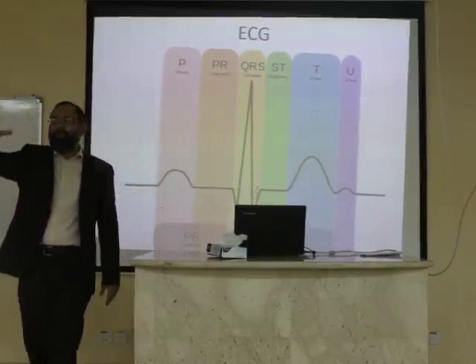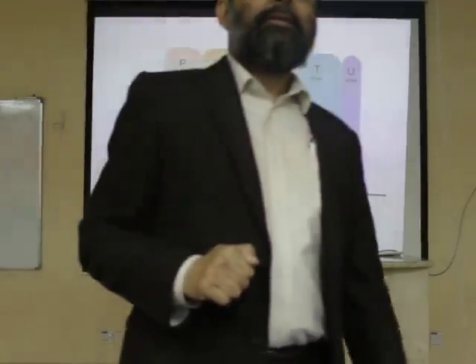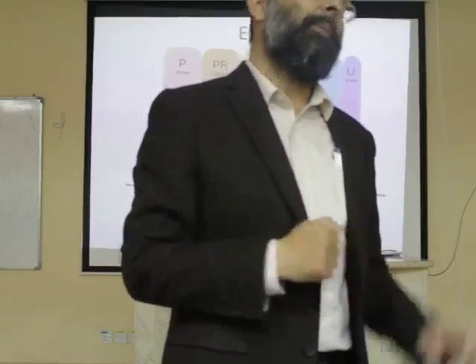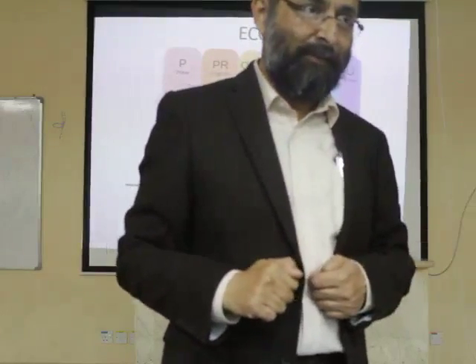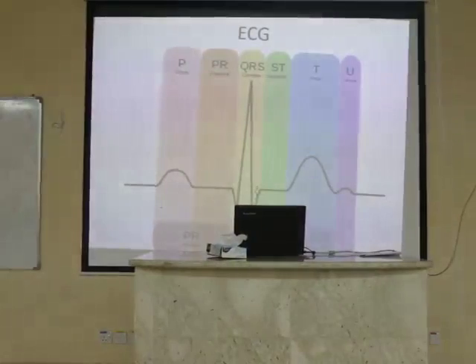Why do we see a positive wave? You might really wonder, sometimes the thinking mind is confused. Sometimes you have a positive wave, sometimes you have a negative wave. Then you try to couple this with depolarization. Okay, maybe depolarization is always positive. But is it so in the ECG? That depolarization is always positive.